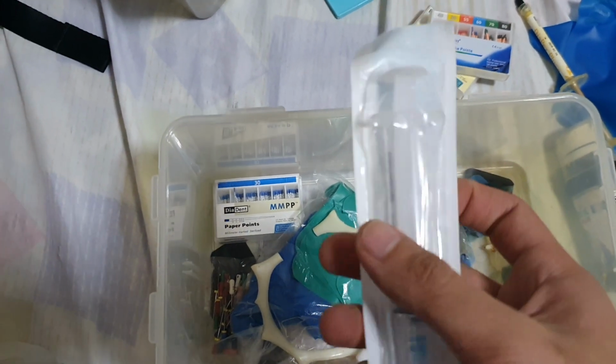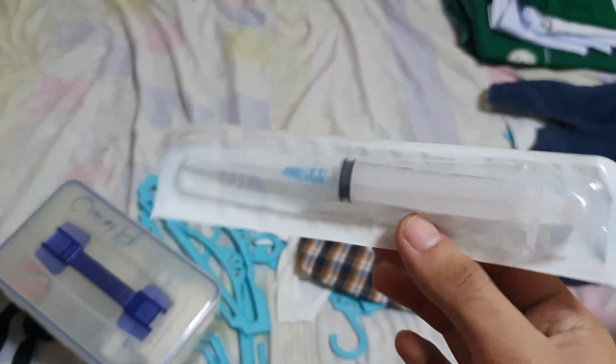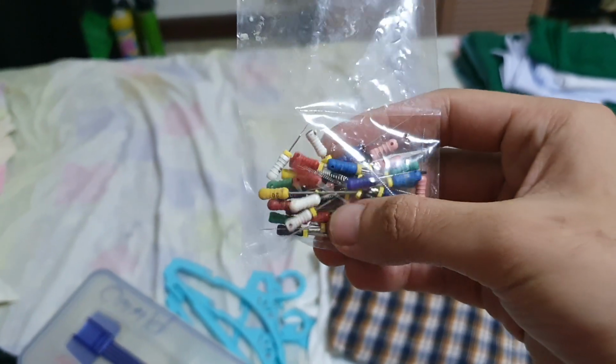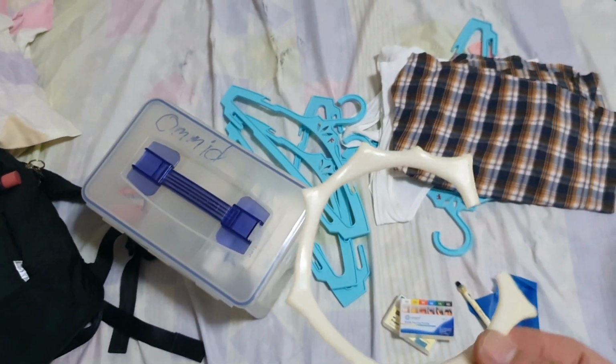And of course, this is for the irrigation, root canal irrigation, for the EDTA solution and for the sodium hypochlorite plus water solution. This is exactly what we use the syringe for. And of course the files. The files come in various sizes and various shapes to clean up the root canal. And this is the rubber dam frame that I was talking to you about.